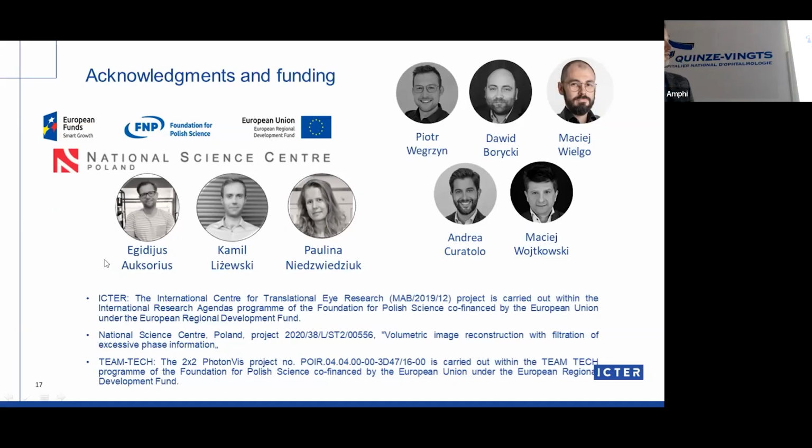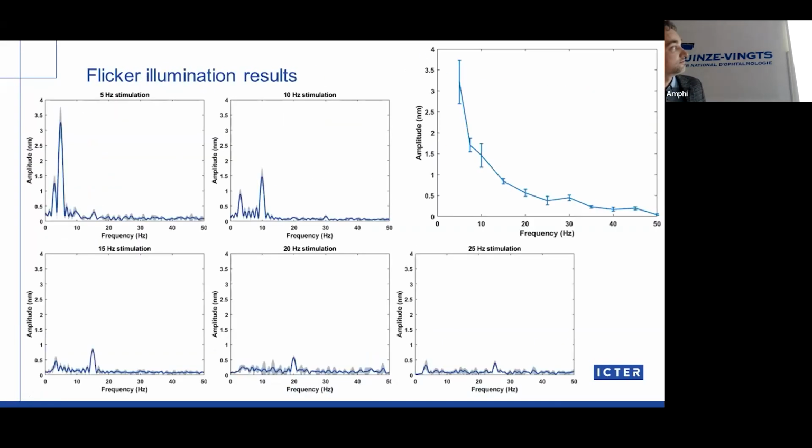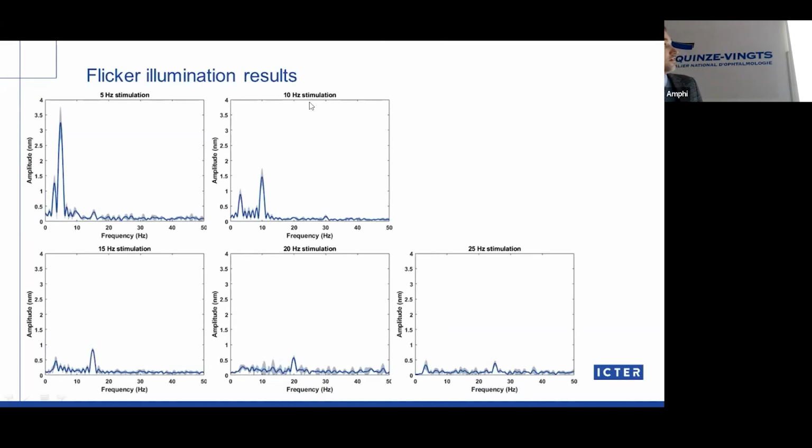So what's the reason for 2 peaks in the power spectrum measurements? Okay, so the peaks here on the left are just the results of remaining filtering of the signal, and the peak here might be second harmonic, we are not sure, and this is for sure also remaining of filtering. So we had some uncorrected movement or changes in the retina due to blood flow that gave some low frequency changes that were not completely filtered from the recorded signal.